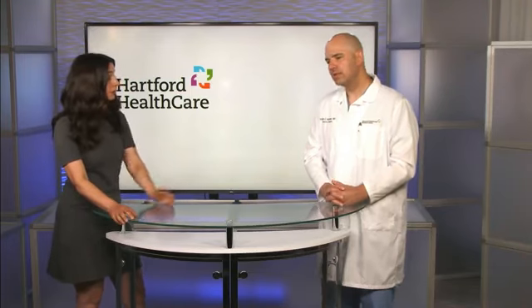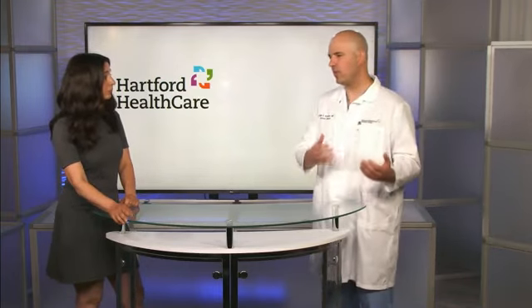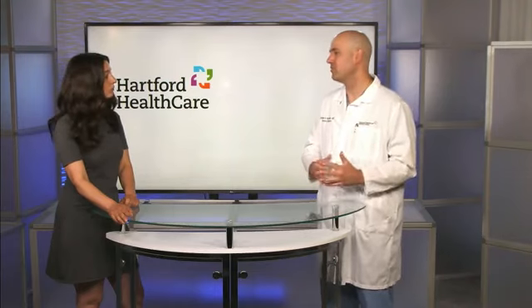Right. Sometimes, because the pathologists are just outside the room, when I obtain that tissue, they can be evaluating within minutes. And then sometimes I've even called the oncologist and gotten them those referrals so that by the time they wake up, we've been able to establish next steps for them already.